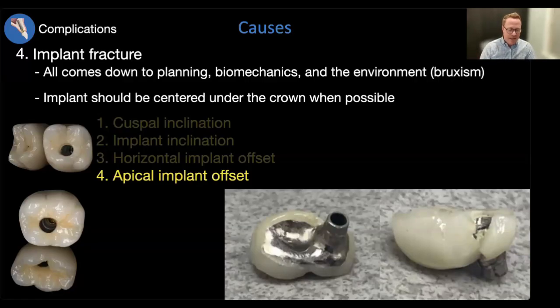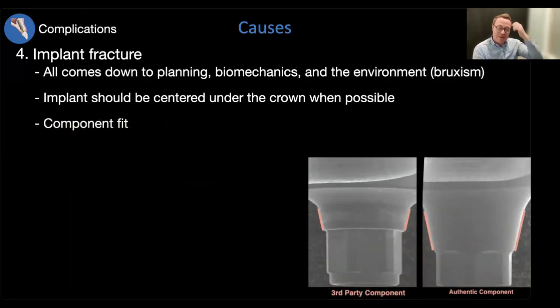And it wasn't that hard, I think, to come up with a reason when you look at the cantilever that this has in a posterior site. So this should have a second implant in that cantilevered space because unfortunately, there's not a lot you're going to be able to do to fix this unless you significantly reduce the mesial distal width of it. But again, that's the key when we look at biomechanics. That's again a big problem.